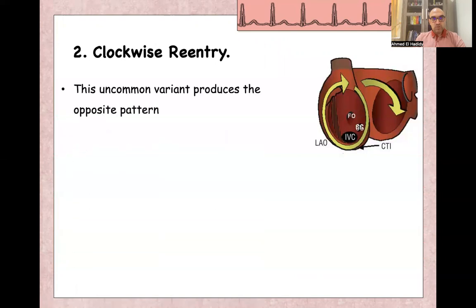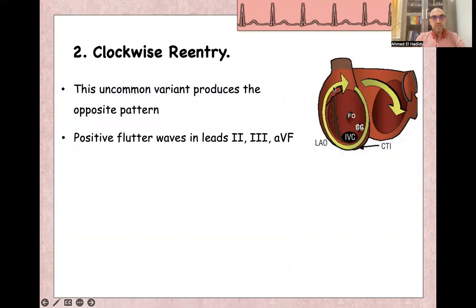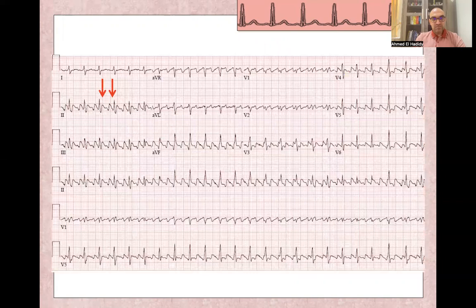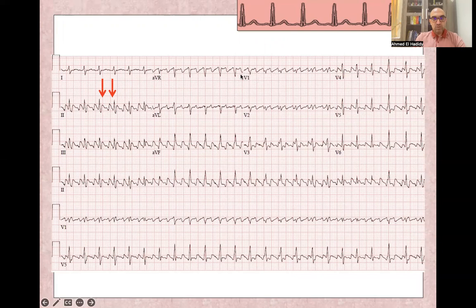For clockwise re-entry, the circuit direction is clockwise, producing the opposite pattern: positive flutter waves in lead 2 and negative flutter waves in lead V1.